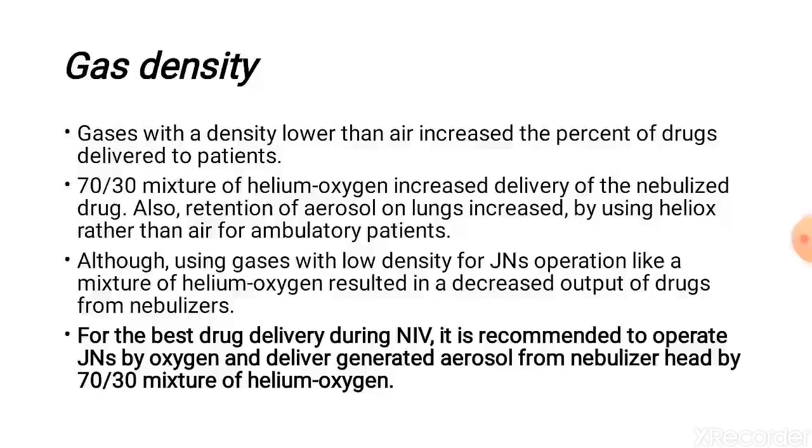However, when we use this mixture to make the jet nebulizer work and deliver the aerosol, it doesn't work very well. So for the best drug delivery, it is recommended to operate the jet nebulizer with oxygen and deliver the aerosol with helium. So the delivery is by the lighter gas and the operation by the oxygen itself.